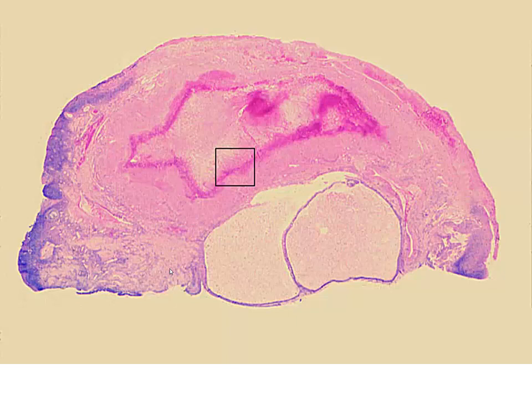Again, just looking at sections through the ovary, here we have a much later corpus albicans, probably, corpus luteum moving into an albicans here. We don't see the folded nature of that. So this one's much older. We can see some of the folds here on the lateral sides, but this one's probably a very old corpus luteum at best as it's beginning to regress. Here we see some very large cyst-type structures. These are going to be Graafian follicles that are regressing as well.